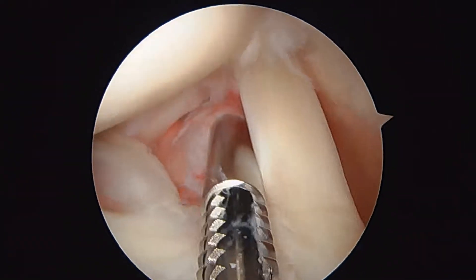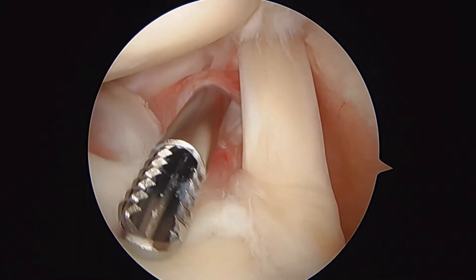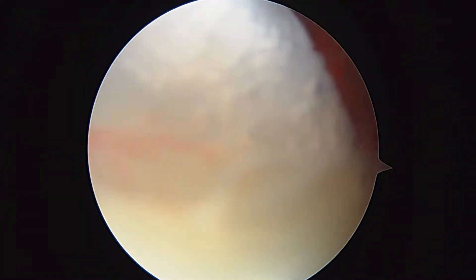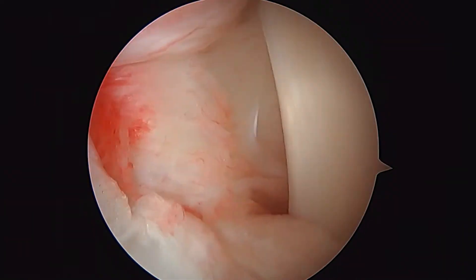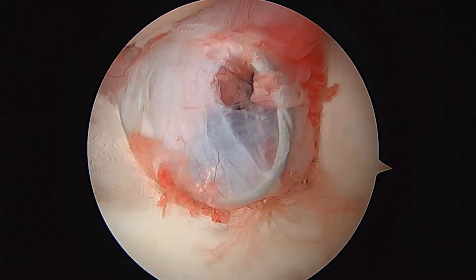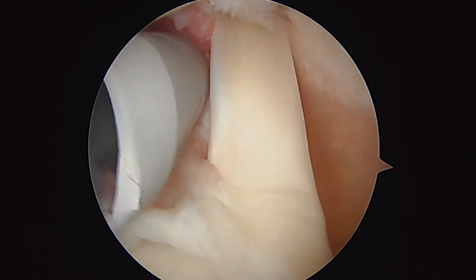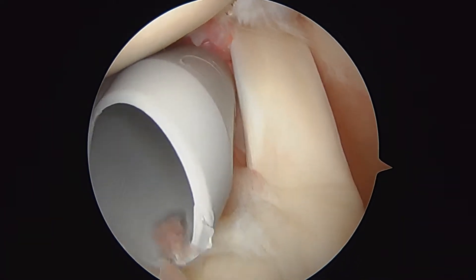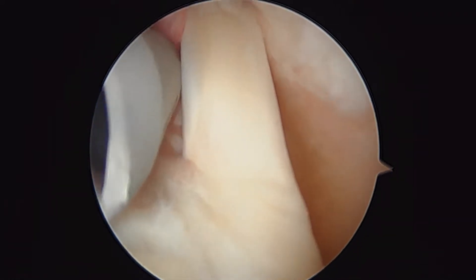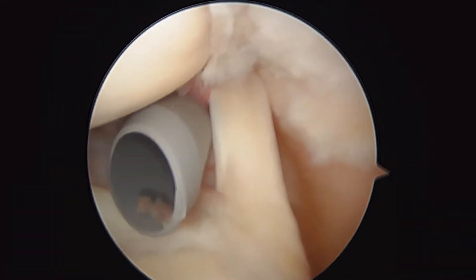I'm concerned that your biceps is involved in some of your symptoms because of how torn it is. We're going to leave in the cannula here, and I'm going to take a spinal needle and show you how we do the biceps tenodesis. You'll see the spinal needle coming through the biceps.